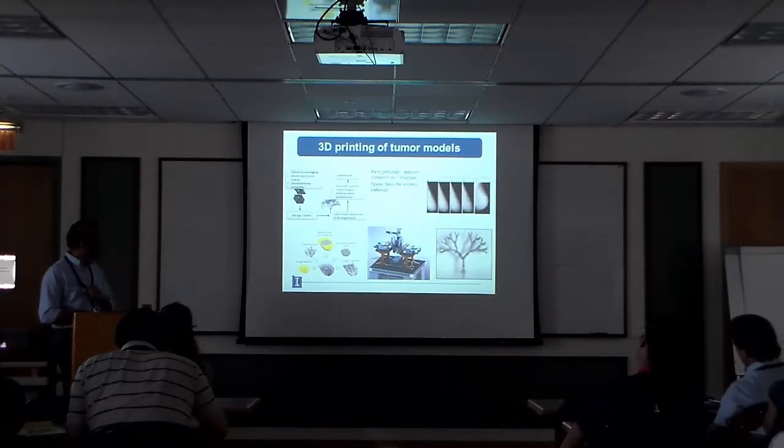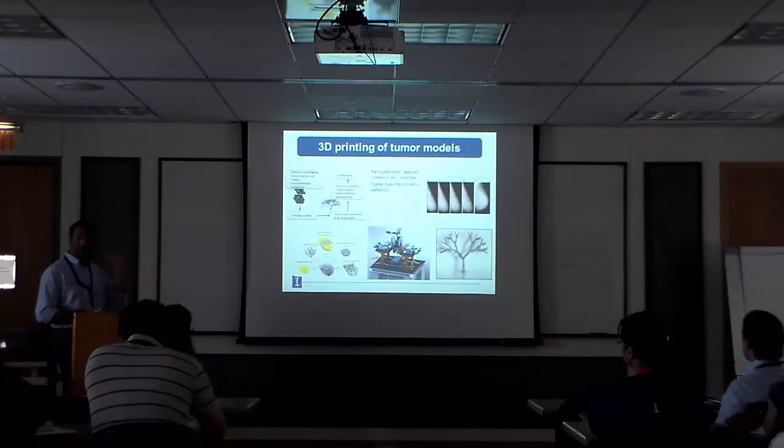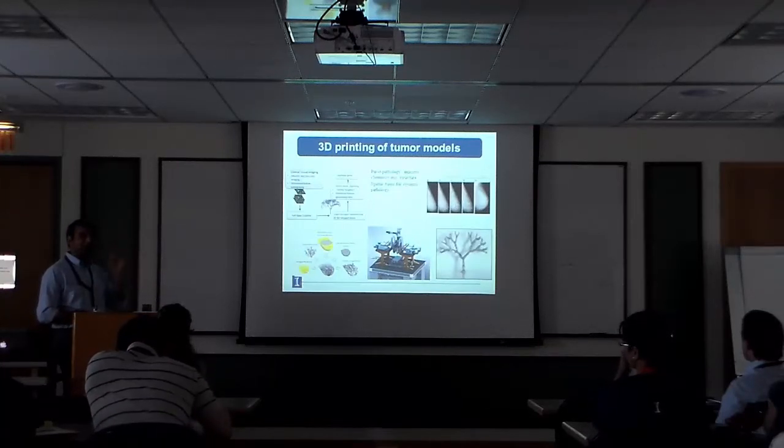We can generate an artificial thing, go in and simulate this. We can say, what would this particular breast that we've generated look like under CT or under ultrasound or what have you? Stick a needle in. Again, this is all computational. Stick a needle in, pull out a piece of tissue, and then go and print it, because that tissue forms the sort of map for our printer to move. And then we can go and print that.